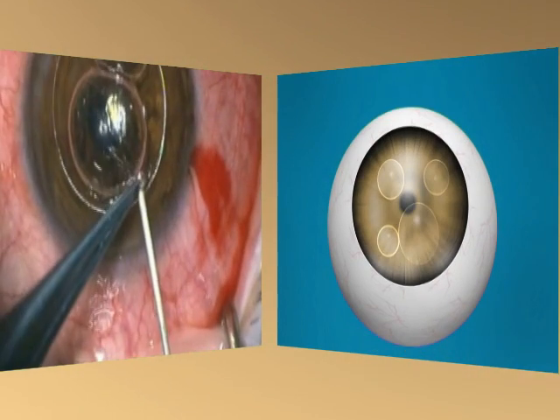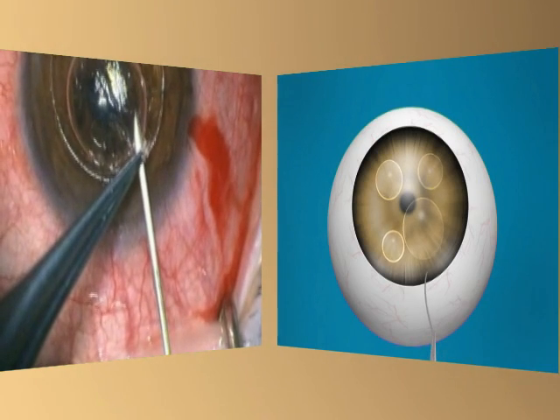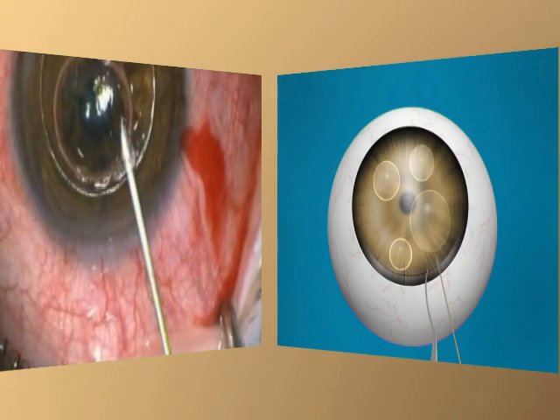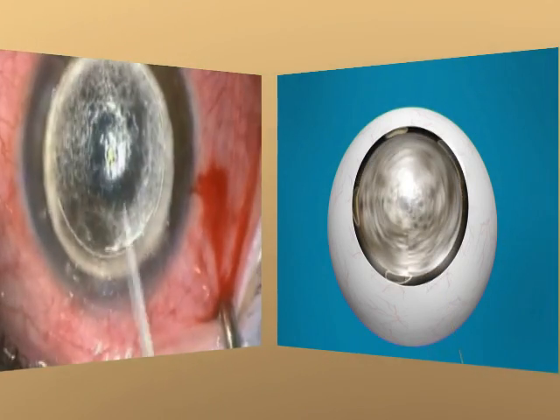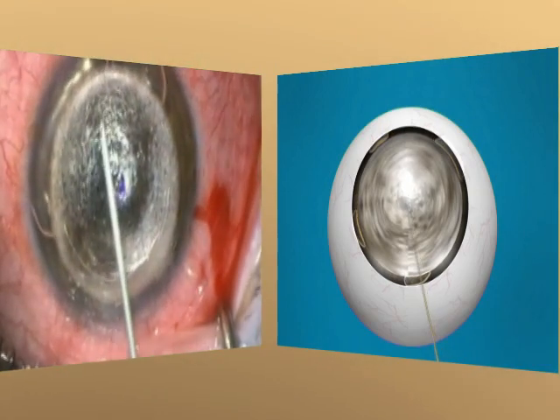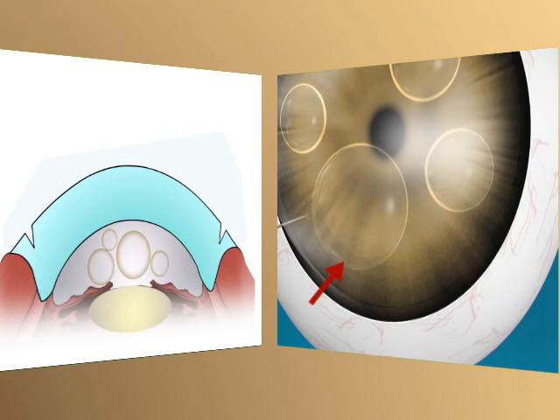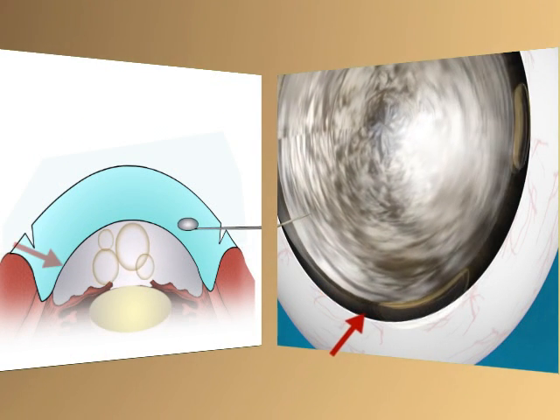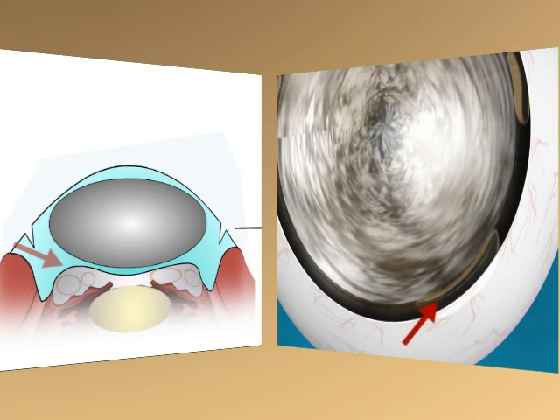Following this, a 27-gauge needle was advanced horizontally in the corneal stroma and then air was injected gradually into the stroma to form the big bubble. Air was injected until peripheral movement of the bubble of air injected earlier in the anterior chamber was noted. This dynamic sign allowed us to immediately cease the injection of air into the cornea, as it was indicative of complete formation of the big bubble.